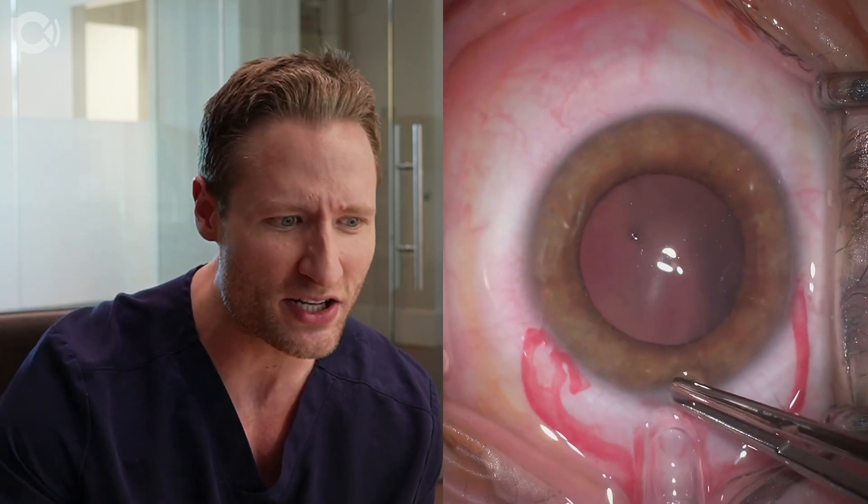I'm back-stopping the eye with my finger, which gives me good control and is comfortable for the patient. Then I instill a preservative-free lidocaine solution to pump up the volume of the AC — it pressurizes the eye and gives me better control when making my main wound. I like to make a relatively small main wound, 2.75 millimeters in its greatest diameter, because a larger wound doesn't seem necessary and a smaller incision may improve patient comfort and healing.